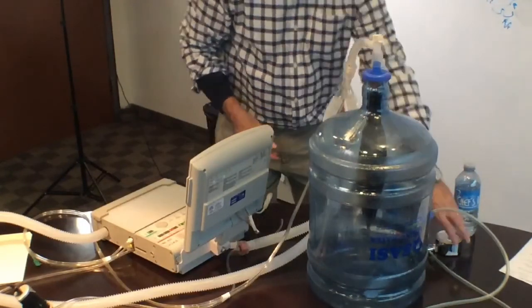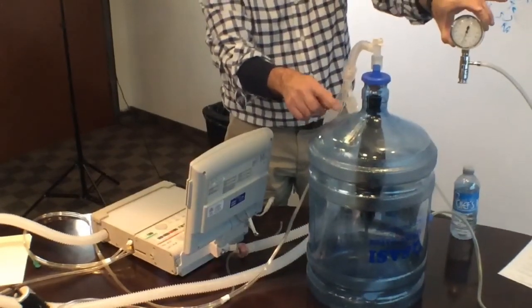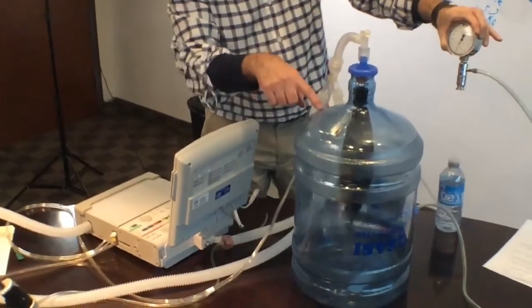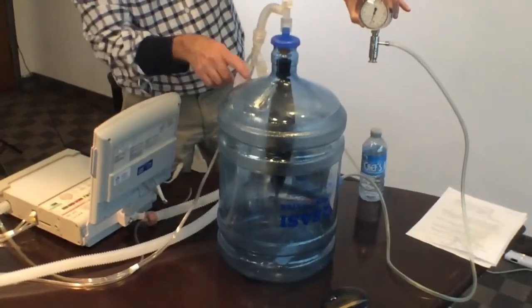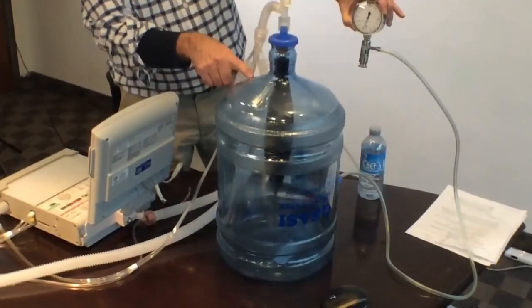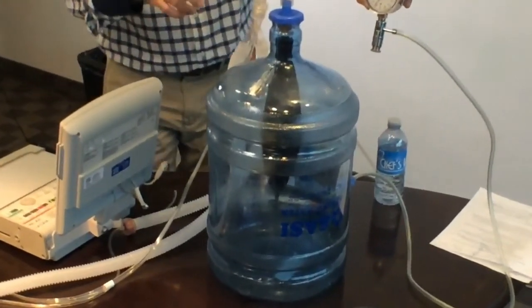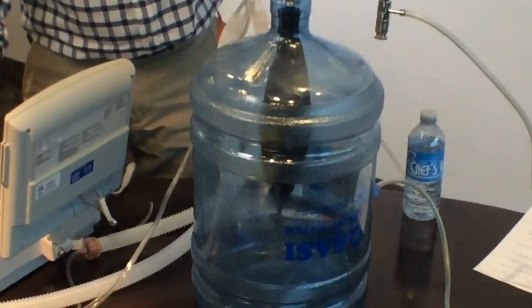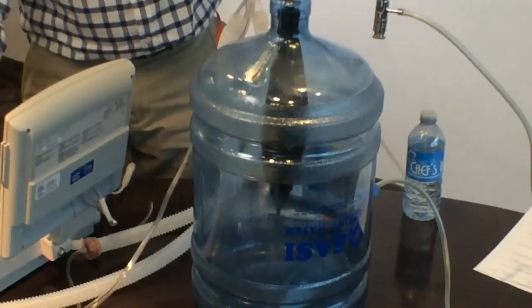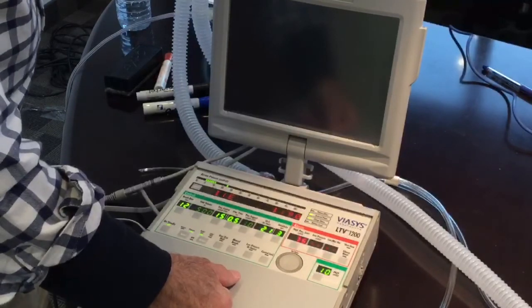So right now, I've got the pressure external to the bladder at 10 centimeters of water, if you're able to see that. So that's 10 centimeters of water, and we have 0 level of PEEP, and we have a pressure control of 15. And you can see that the machine is struggling to try to get any tidal volume into this patient at all. So what I'm just going to do is leave the pressure control of 15 alone, but turn up the PEEP to 10 centimeters of water. So it'll take a couple of breaths for this to demonstrate itself.